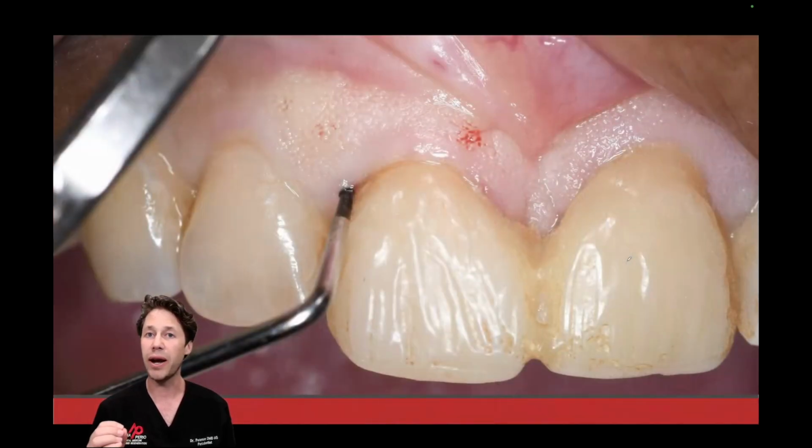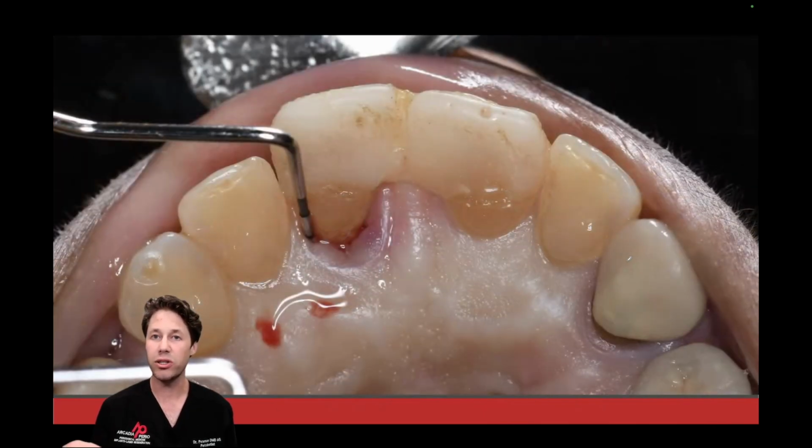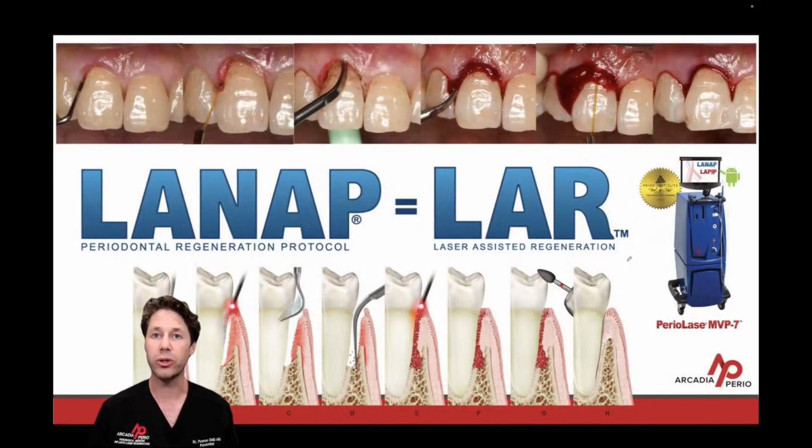So let's look at our periodontal bone sounding probe depths. Here we are on the distal aspect. We're getting about a 10 or an 11 from the facial. But let's look at that localized inflammation on the palatal aspect. That area probes approximately 8 to 9 millimeters, and that defect extends along the entire palatal aspect of tooth number 8. So how are we going to treat this tooth?